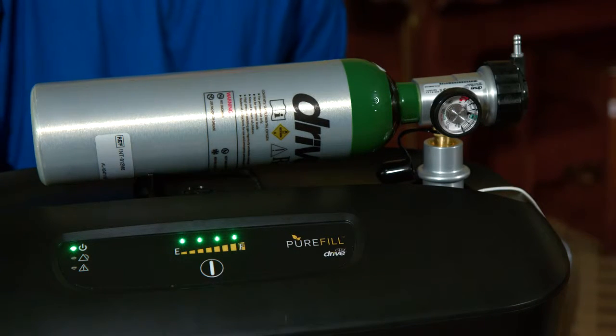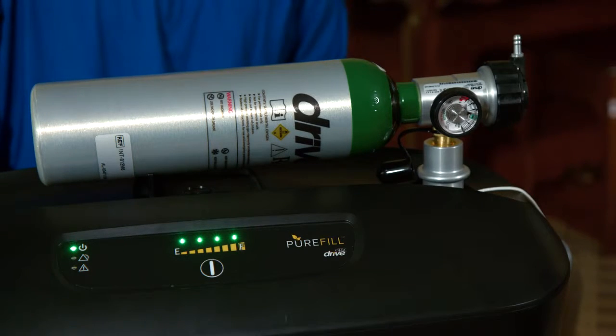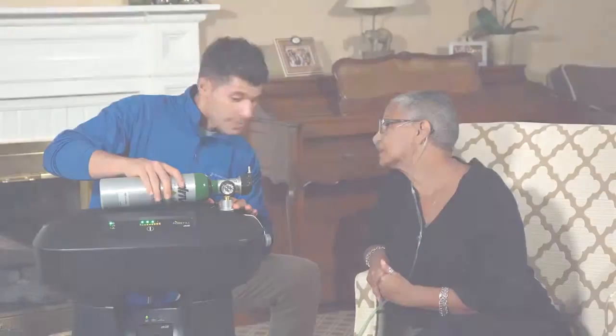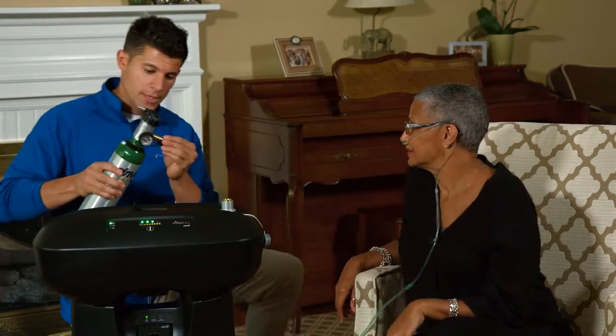At that point, the PureFill will not turn off, but will automatically sense the pressure in the cylinder and stop the fill cycle. Remove your cylinder from the cylinder port by gently pushing down on the port with one hand, and firmly grasping your cylinder with the other.